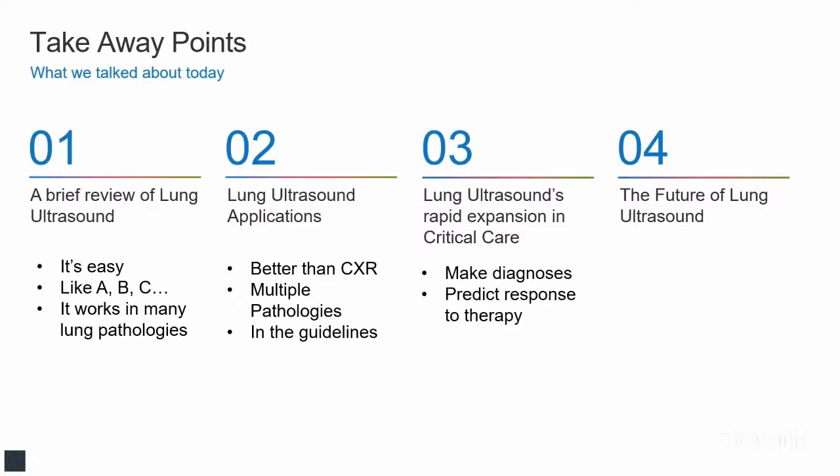In critical care specifically, we can use it to make diagnoses, and we can use it to predict response to the therapies that we use for our patients. And in the future, we're going to have this being applied outside of the ICU, outside of the hospital, being used by non-physician providers and by patients themselves, breaking the boundaries on how this technology can be applied.